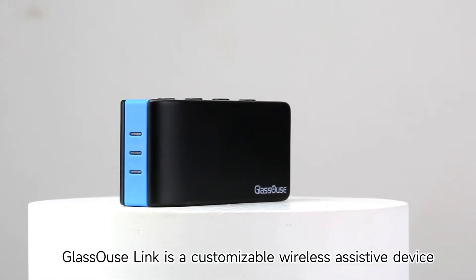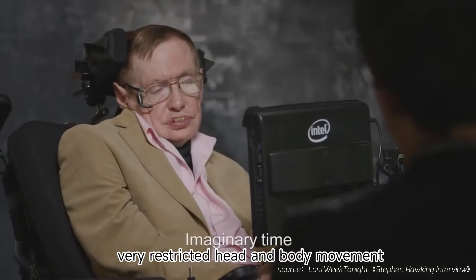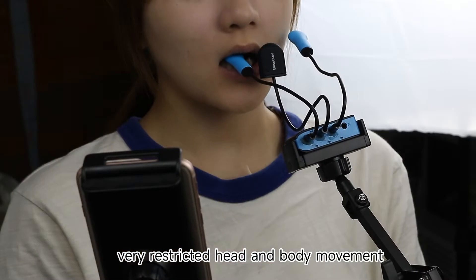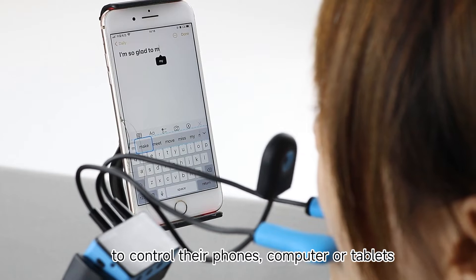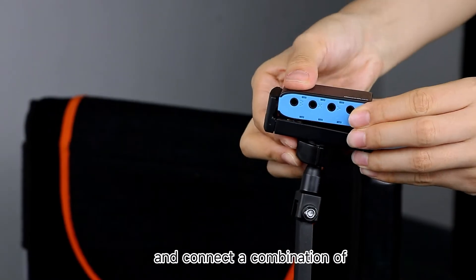GlassOuse Link is a customizable wireless assistive device for people with disabilities having almost no or very restricted head and body movement, to control their phones, computers, or tablets. Users can attach GlassOuse Link to their wheelchair and connect a combination of bite switches and puff switches to the device.